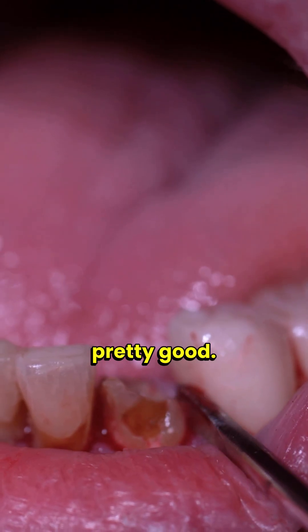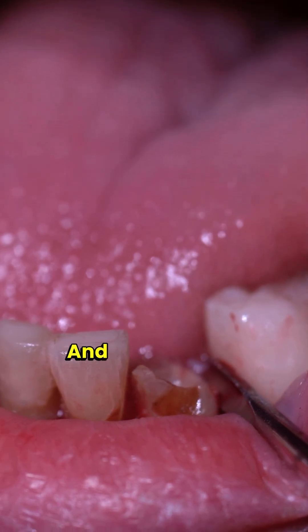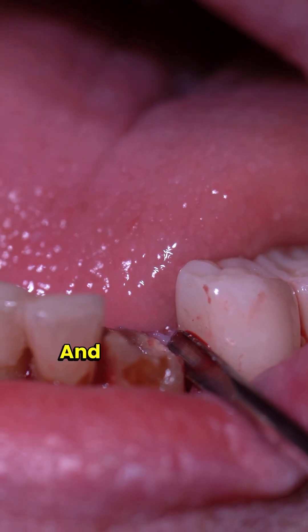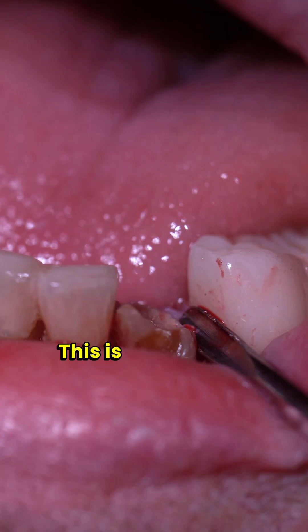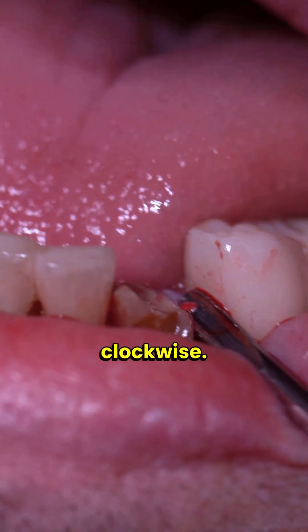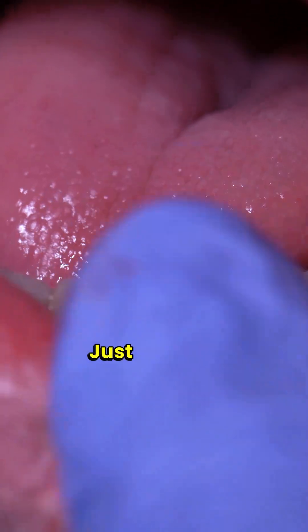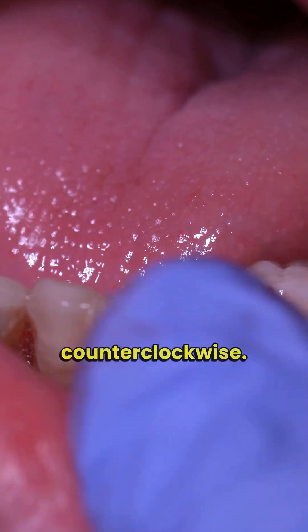Now I'm going to use my elevators. I put my elevator straight up perpendicular to the tooth, putting pressure against the adjacent tooth — you do want to be careful. This is just the way I start: perpendicular to the tooth, rotating clockwise. If I had more tooth structure I would also rotate counterclockwise. I go to the other side and rotate clockwise and counterclockwise.